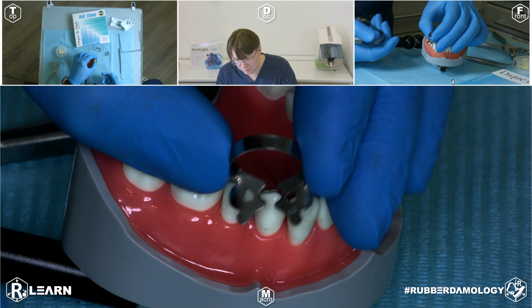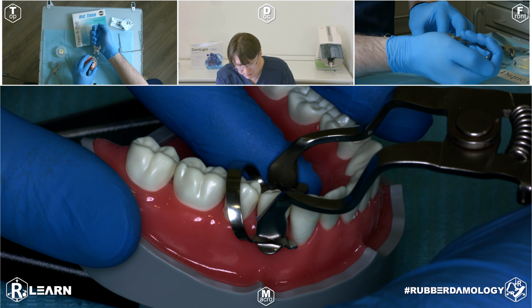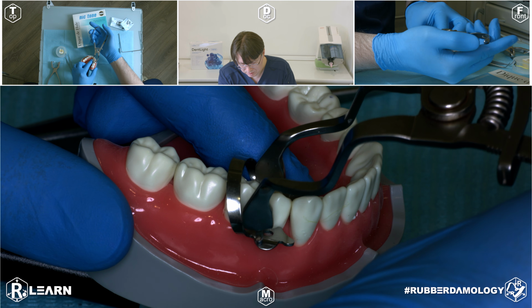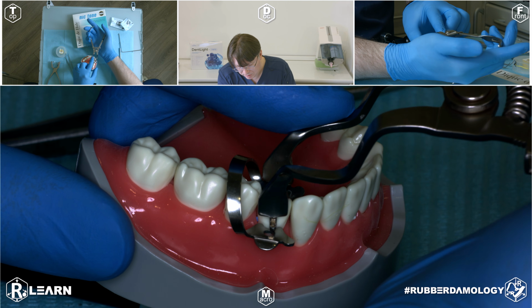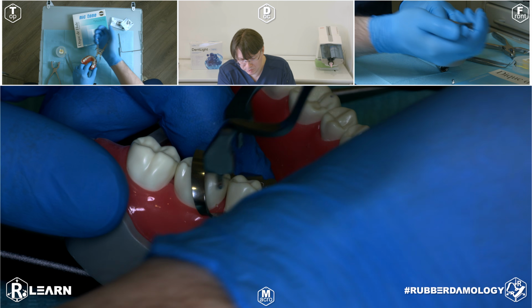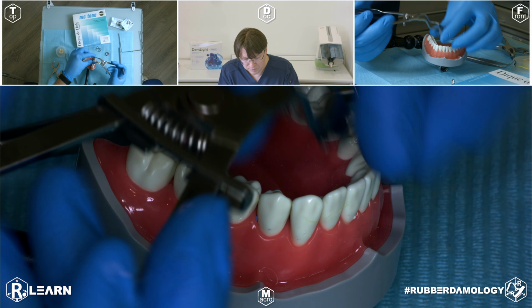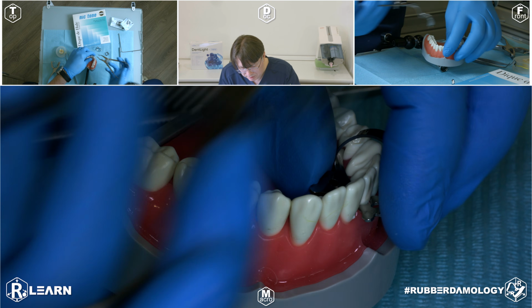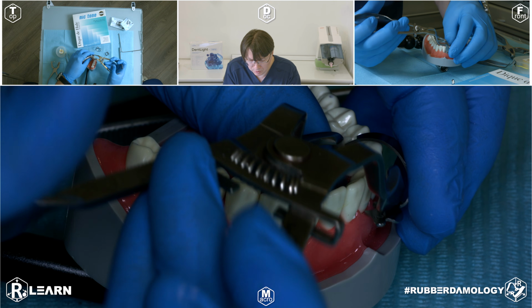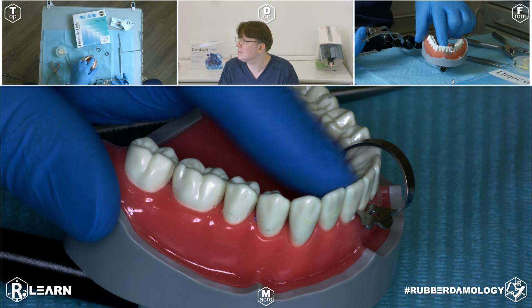Clamp number 2, wing clamps. Ideal for premolar, first premolar, the second premolar, very good. It's also possible to use it for incisors, but for incisors I advise you to use clamp number 0 or 00 in different systems. It's more stable on a small tooth.